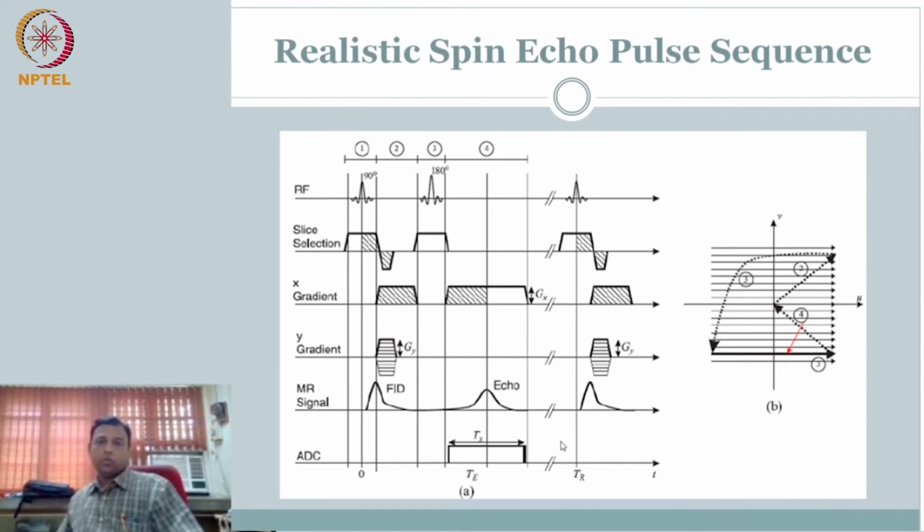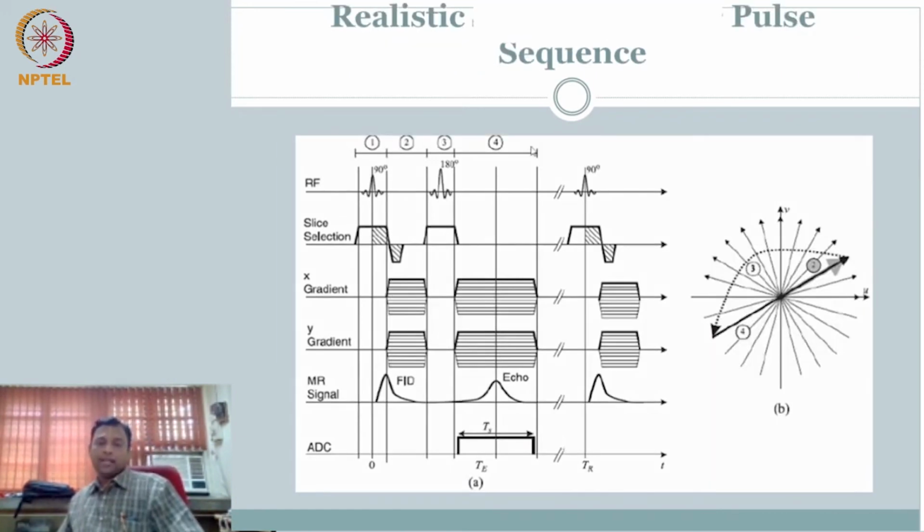Okay, so now last but not the least, can you again do the same exercise? This should be fairly straightforward, right? Oh, I see this. I should perhaps not have shown this. Maybe that will be the task in the exam or homework, right? So the idea is, look at the sequence. Can you guess the path? Look at the sequence. I have an RF pulse, but I am applying X and Y simultaneously along with slice selection.